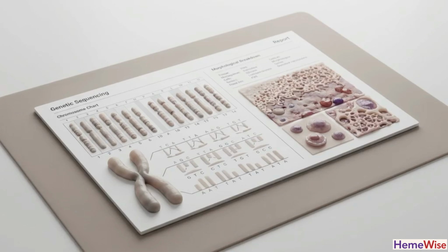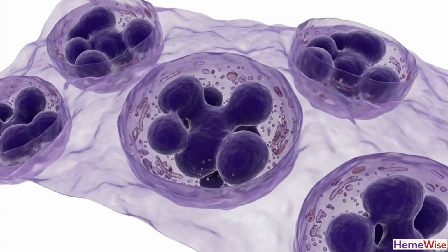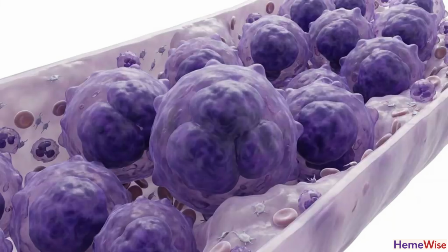In myeloproliferative neoplasms, we contrast essential thrombocythemia, which features large hyperlobulated megakaryocytes, against prefibrotic primary myelofibrosis, which shows dense clusters of megakaryocytes with abnormal bulbous nuclei.